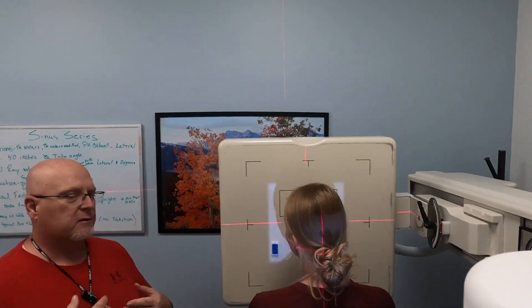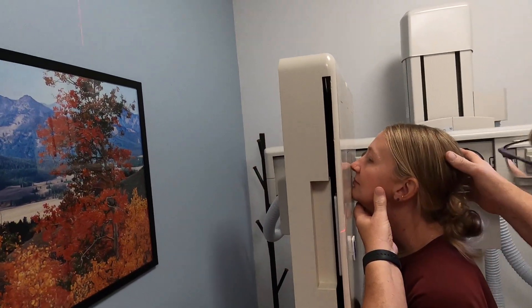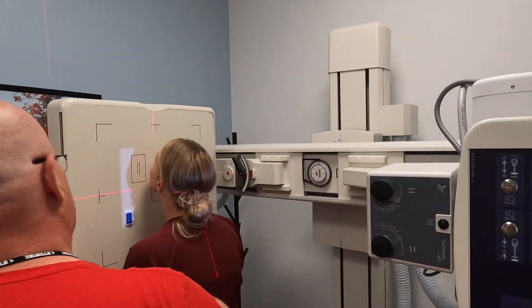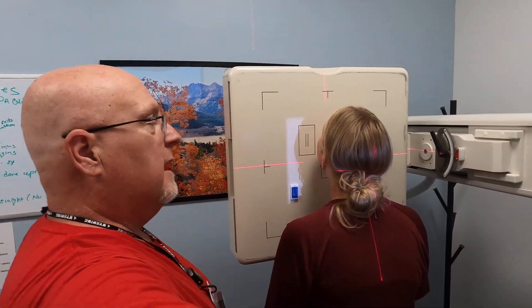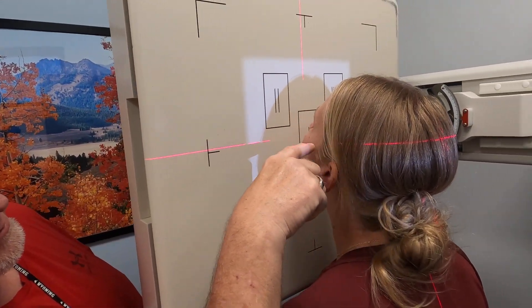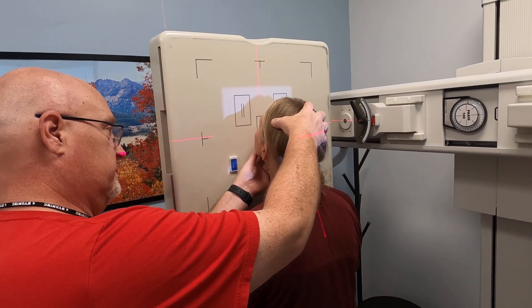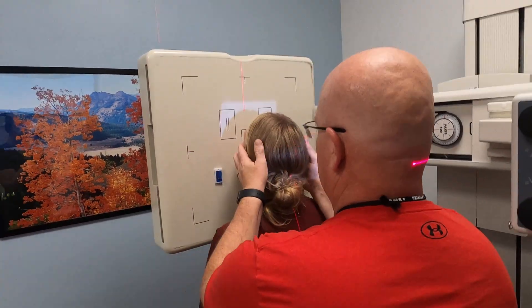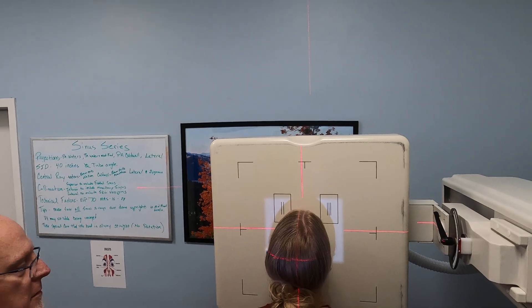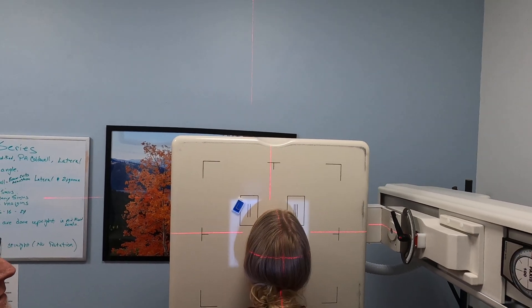Now for the Waters view — just remember you want to keep their head out of water. They're going to put their chin forward and let their nose touch ever so slightly, then come back off from the board just a little bit. The central ray for this one is going to exit right below the nose — the acanthion. The central ray line exits right at the top of Kate's lip. Her chin and her nose are almost touching the board. Make sure they're straight, and we collimate down because we don't need the top of the head. Central ray exits the acanthion — and there's your Waters view.